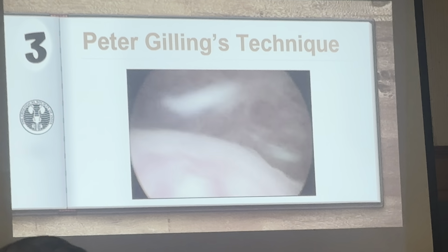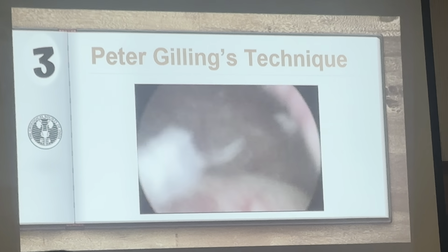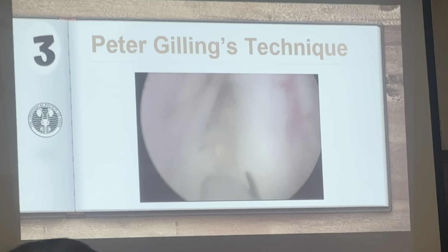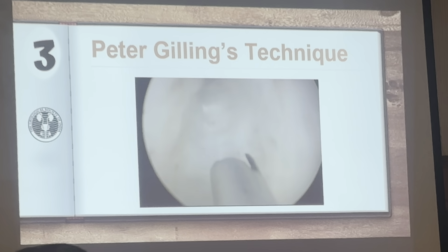Deep, and then there is a shallow groove on the right side. Always mark your ureteric orifices whenever there is a median lobe. So once we have identified the anatomy correctly, we start with the median lobe enucleation. I call this the mushroom technique. So we have to mushroom all the lobes one by one.